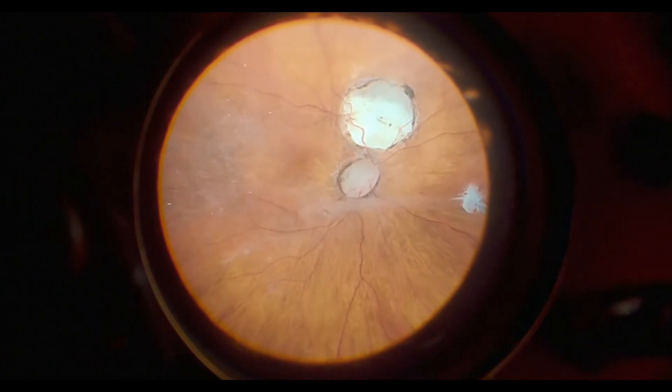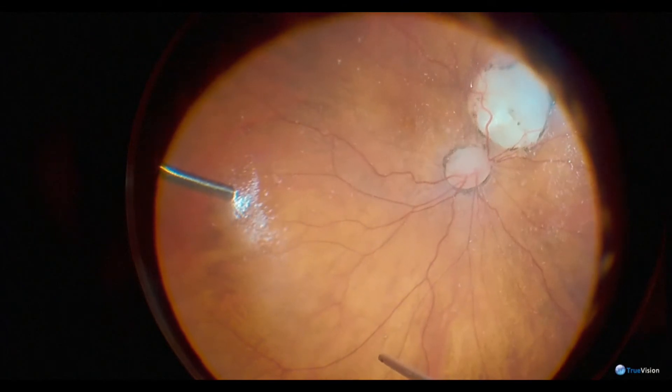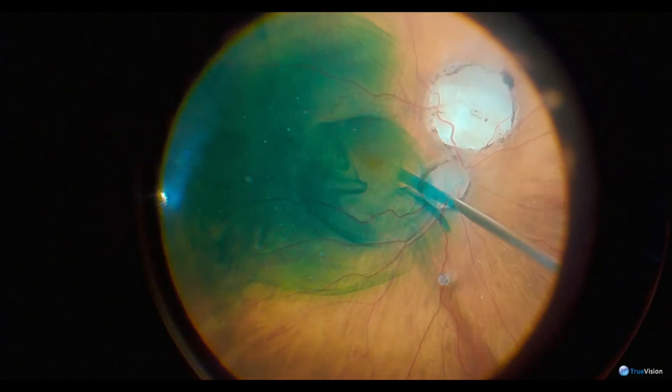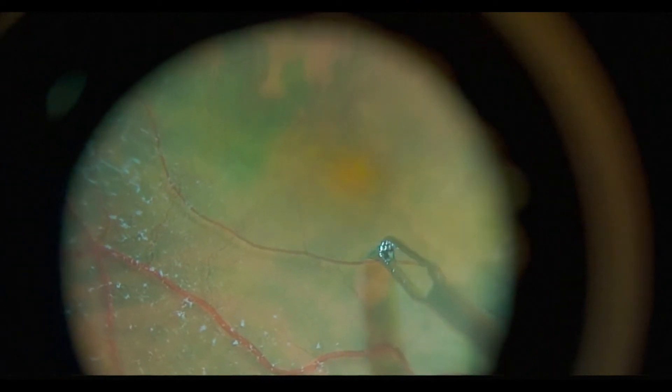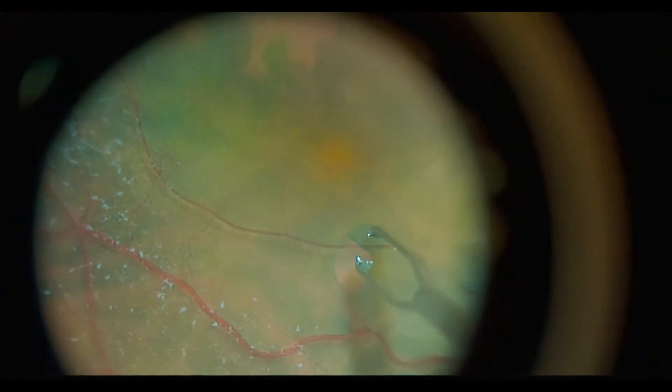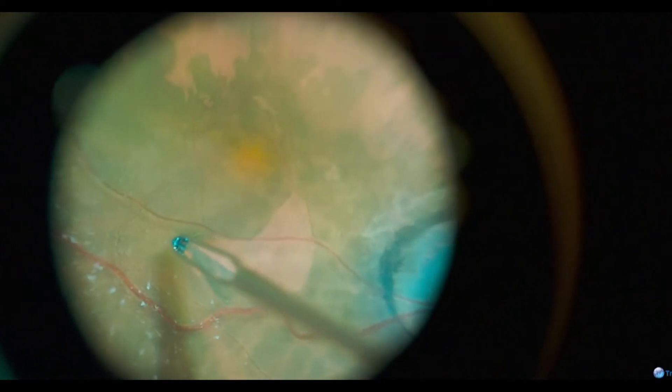This is a really interesting patient who had an optic disc pit associated with a coloboma. We did a vitrectomy first, identified and made sure the hyaloid was up with intravitreal triamcinolone — that's the dusty white stuff that you see there.